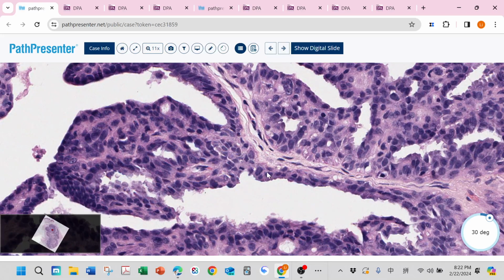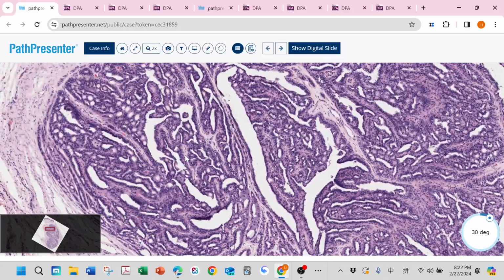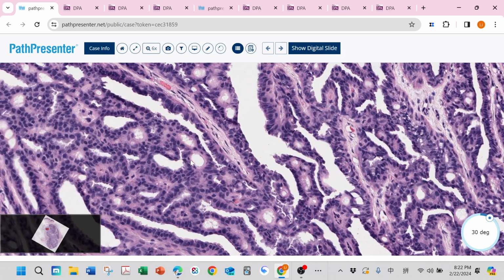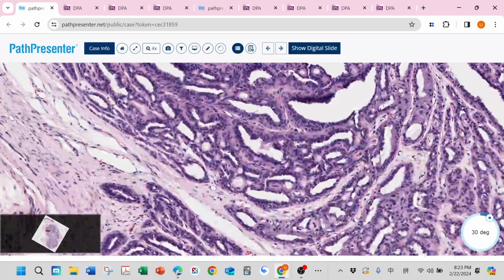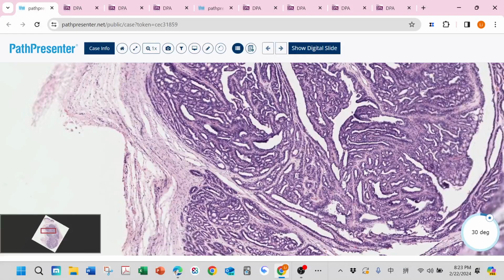But inside, we also have this myoepithelial cell. So combine this maze-like structure and this ductal differentiation, two-cell layer, epithelial cell inside and myoepithelial cell outside. That's really good for Hidradenoma Papilliferum.